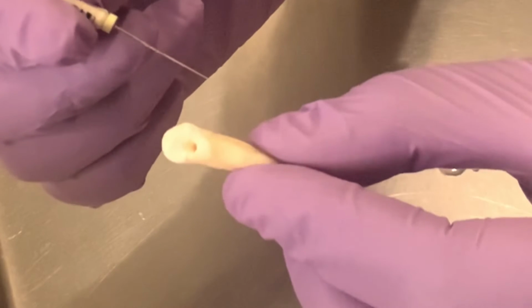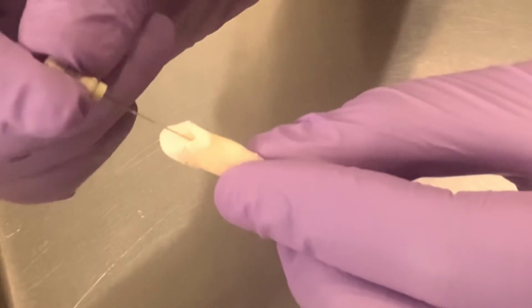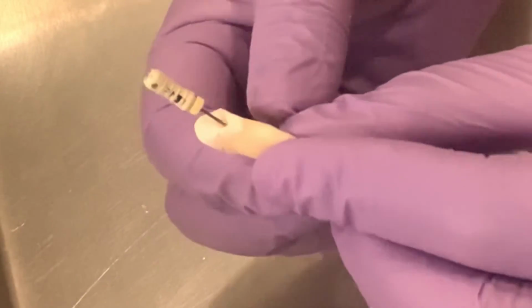With help of a 15 number file, we'll explore the root canal orifice and enter into the root canal. You can see a straight line access has been achieved.